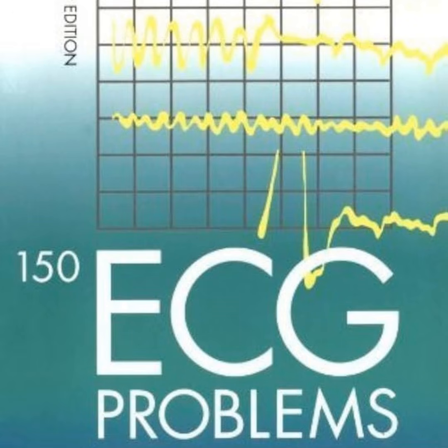In the context of ischemic heart disease or a previous myocardial infarction, a broad complex tachycardia must always be treated as ventricular tachycardia. No exceptions. Unless you have a prior tracing proving they had a pre-existing bundle branch block, you assume VT. Because that post-MI scar tissue forms the perfect re-entry circuit for VT. It's the ultimate do-not-miss diagnosis.